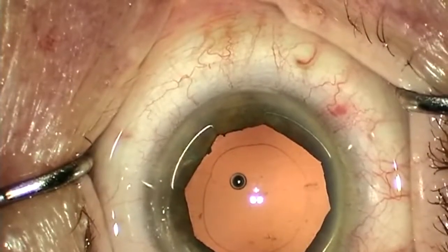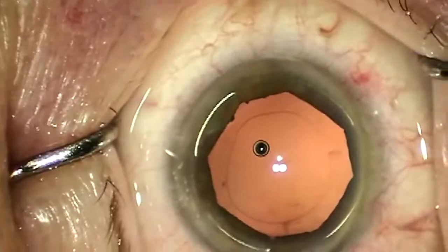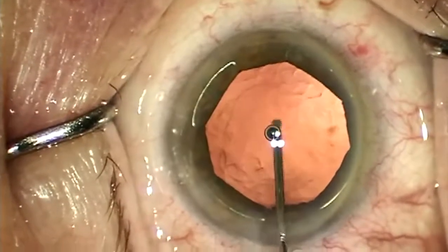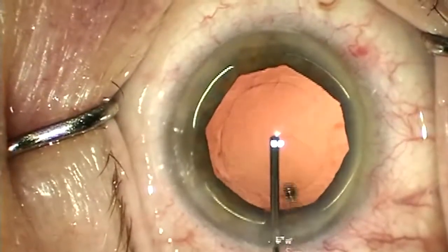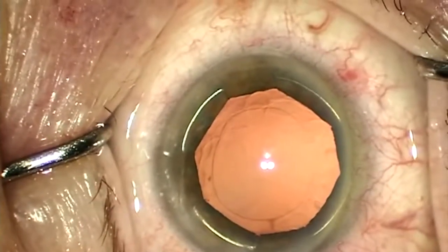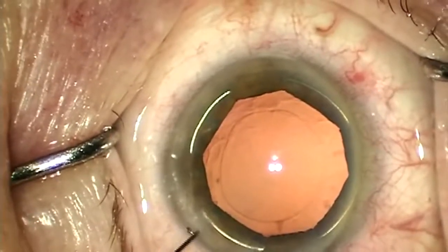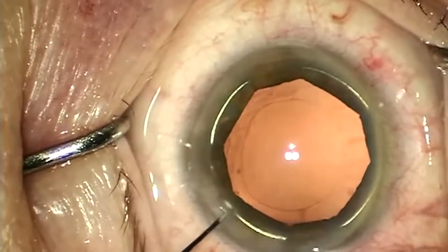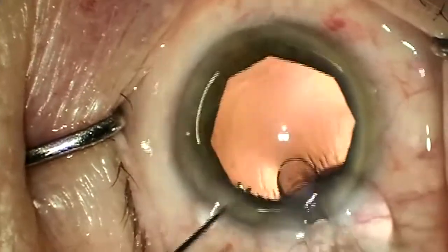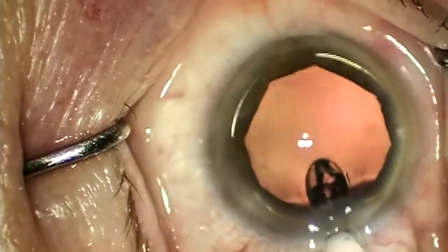Now we'll switch to the next case, which shows a good example of the removal of the X-band speculum. The capsular bag and anterior chamber are inflated with viscoelastic. Your lens of choice is implanted into the capsular bag and rotated into your preferred orientation. Be sure that the haptics of the lens implant are not stuck to the optics and are allowed to fully expand.